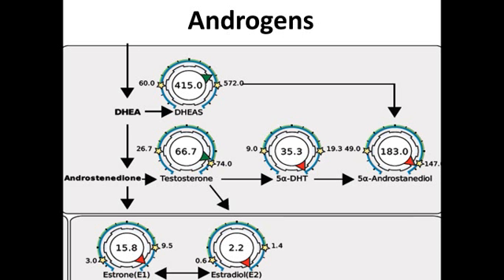If we start from the top, we'll note that we're not measuring DHEA, which is sometimes a common misunderstanding with urine testing. We're really reflecting the sulfate, DHEAS, which there's a lot more of in blood, and when you look at urine, what we're really measuring is total DHEA.